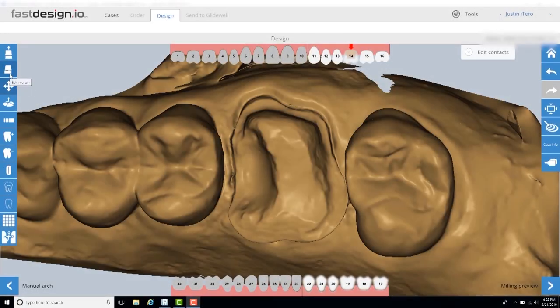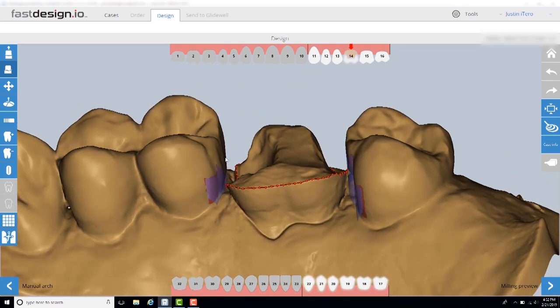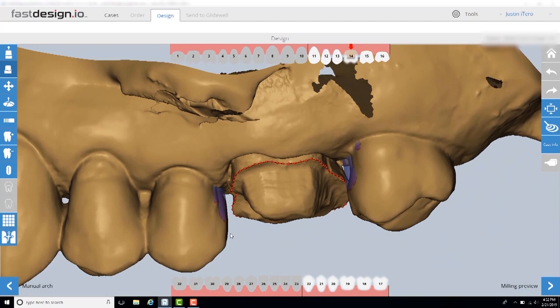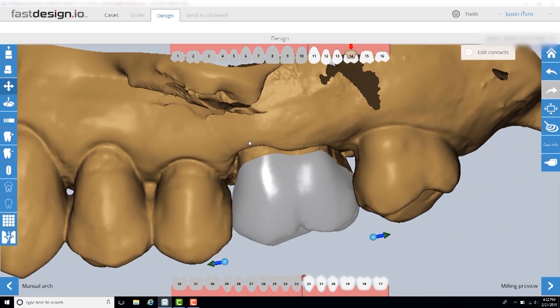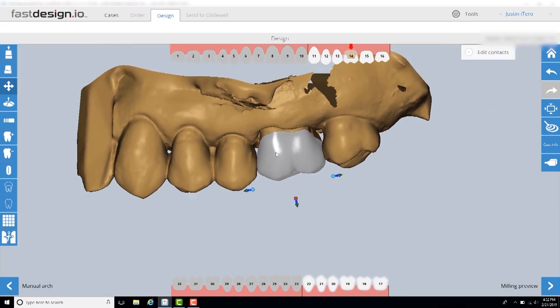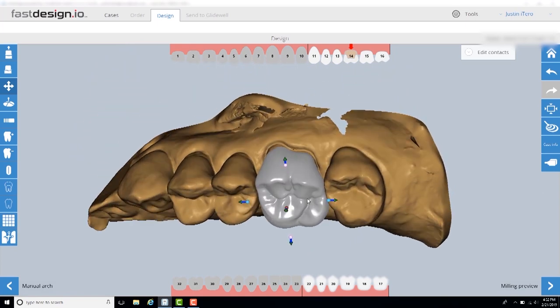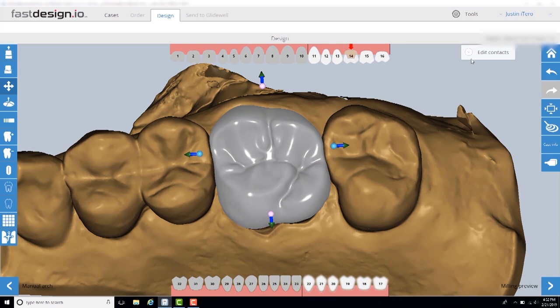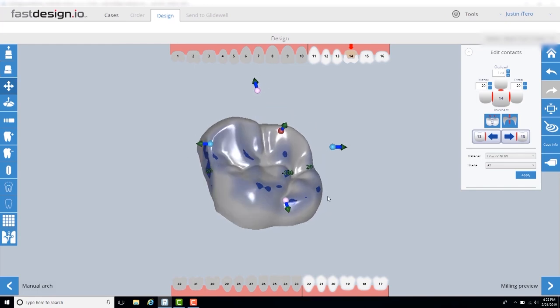The first step in the Fast Design software is margin marking. The margin is designated by the red dotted line, and I rotate the model around to ensure the line is marked correctly. Once the margins are set, the software generates a functional and aesthetic design that fits the restorative space. Incredibly, the entire design process typically takes less than three minutes. I'm grateful to the 60 software developers who dedicated over 700 man-years to create this very easy-to-use design software.